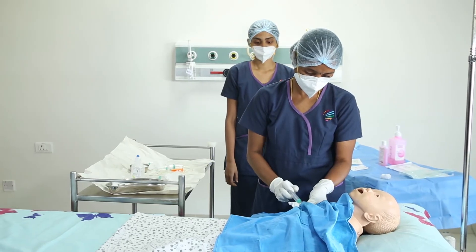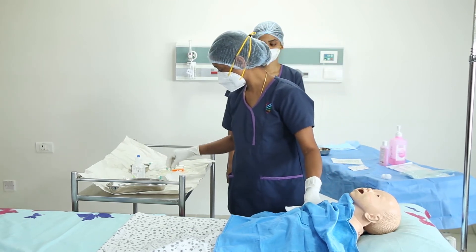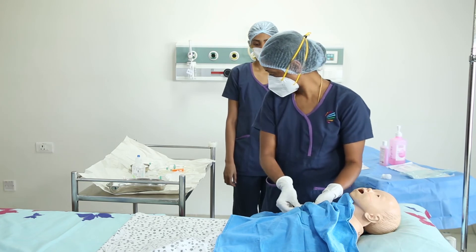She will then clamp the line and disconnect the syringe. The line end will be secured with a cap and covered with a sterile gauze piece.